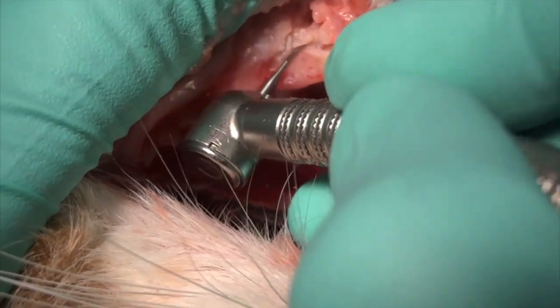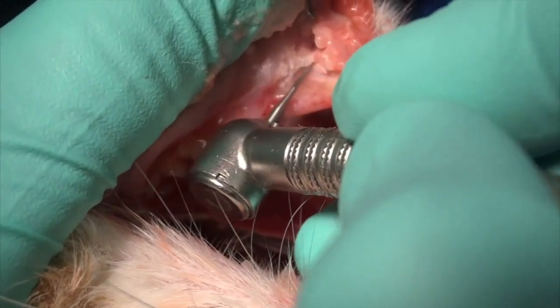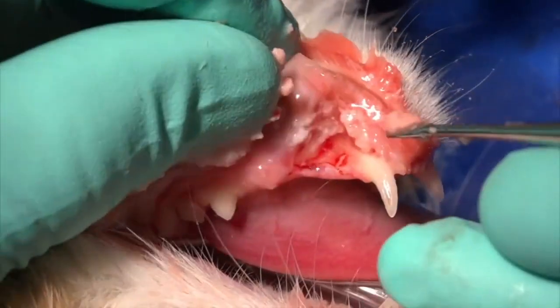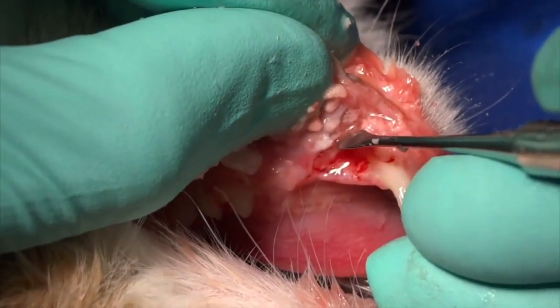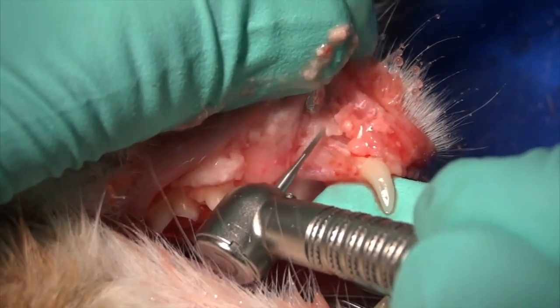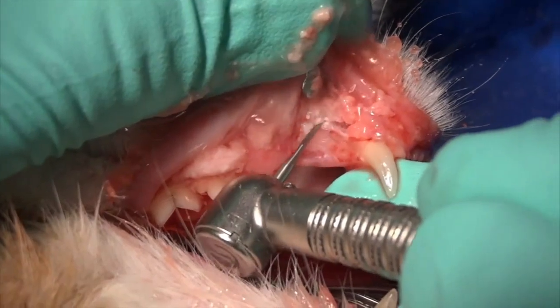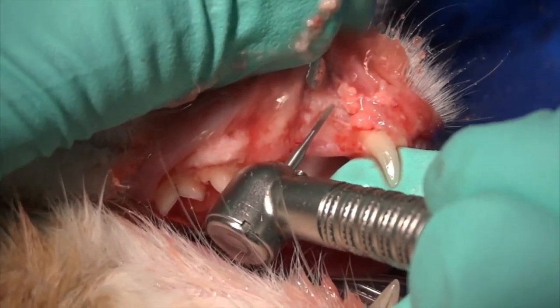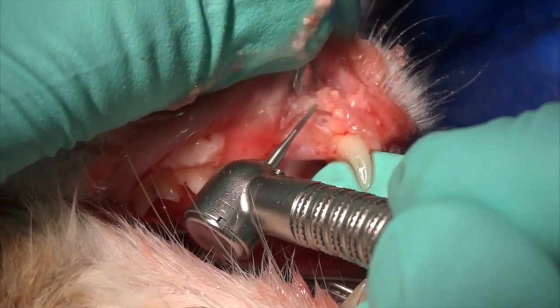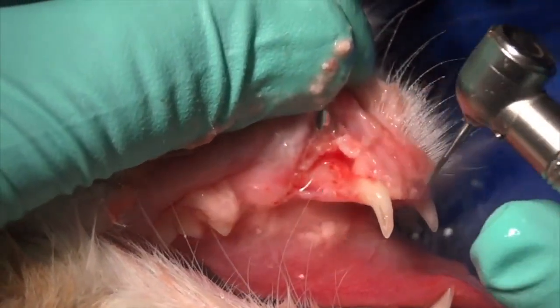We're taking care not to get too far distal — we don't want to disrupt that middle mental artery and nerve if possible. If you do, it's not associated with a huge amount of morbidity. It'll bleed, but the main concern is whether we damaged the nerve and whether that will cause discomfort or pain in the future. You want to try to stay away from that if at all possible, as we're more concerned with the nerve getting damaged and then having neurogenic pain as a result.